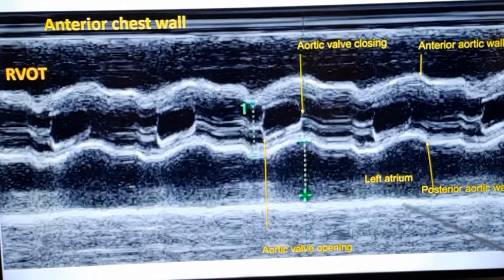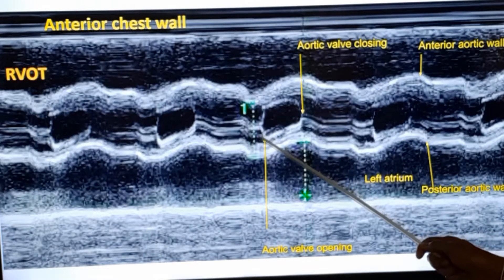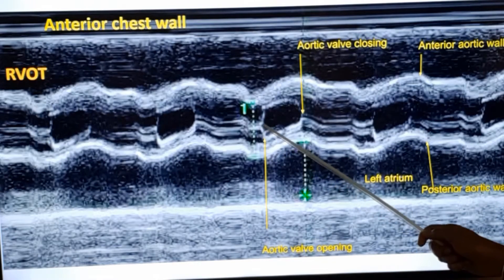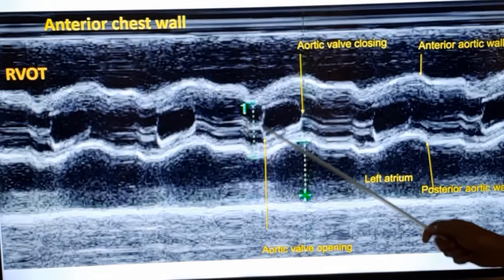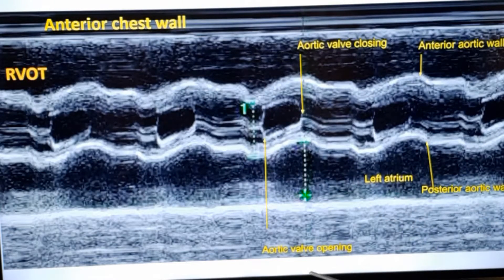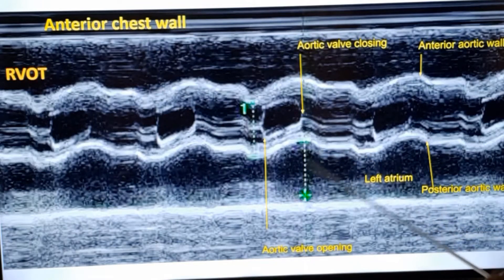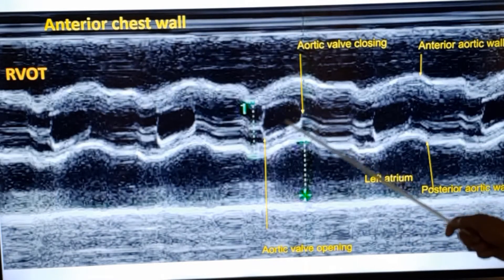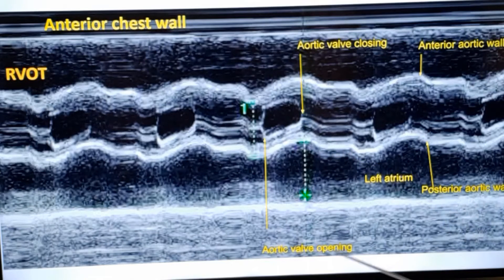This is the left atrium. You can see the opening of the aortic valve. This is the opening excursion of the two leaflets of the aortic valve, and this is the closing moment. From this distance you can approximately identify the aortic valve opening — how much it is opening, whether it is partial opening or complete opening.